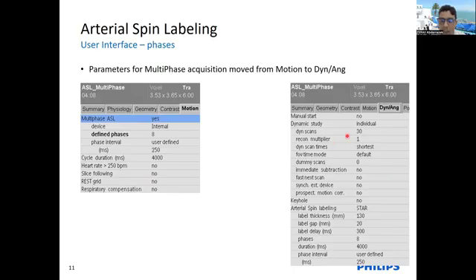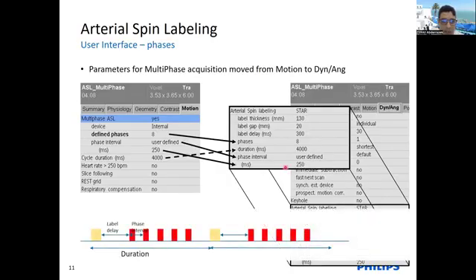So also for the dynamic, just to make sure about the parameters that we used, the dynamic scans, maybe we can go through 30 dynamic scans. You see just the mode here for the arterial spin labeling. You can modify, as you know, by STAR or pseudo continuous or QUASAR, or just make sure that this parameter is dependent on your package that you put inside the acquisition. So this is the phase, this is the mode, this is the parameter that you can use. This is the duration between the delay and the control image, and you can repeat through different dynamics.